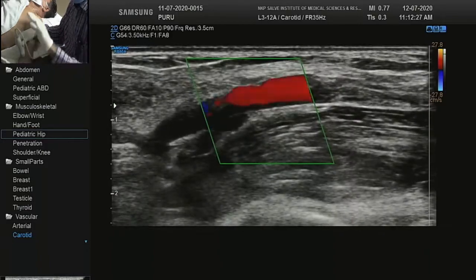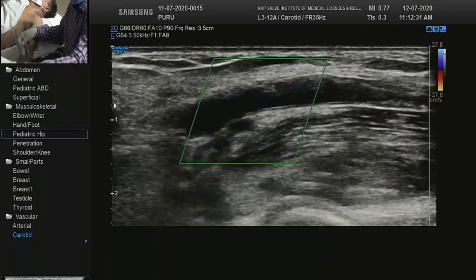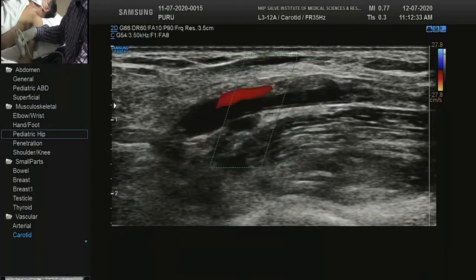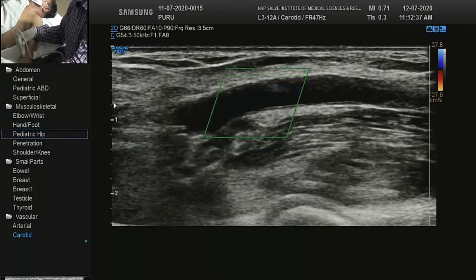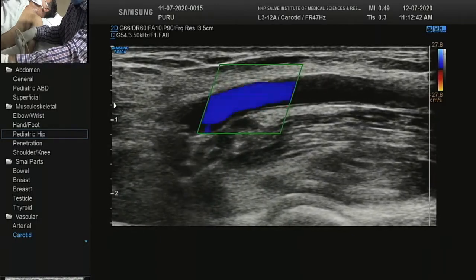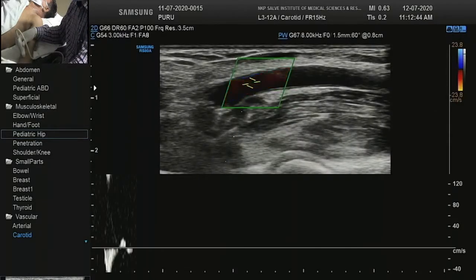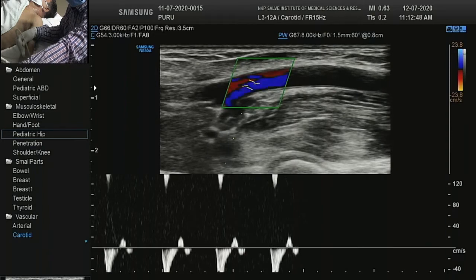If you sample where it makes the angle, it becomes easy. You don't need to adjust many things. So we will reduce the width, we will reduce the height also. Width is more important, but height also you should keep less, so that the machine doesn't have to work much for you, and it gives you every information quick.